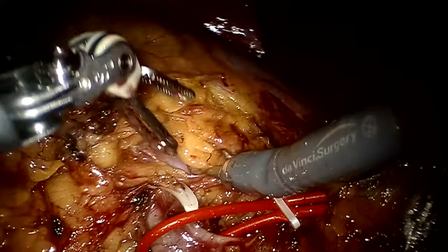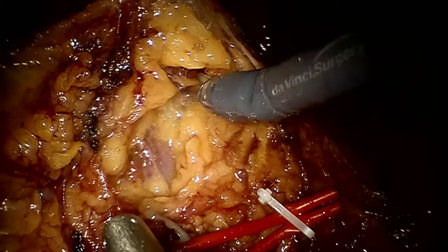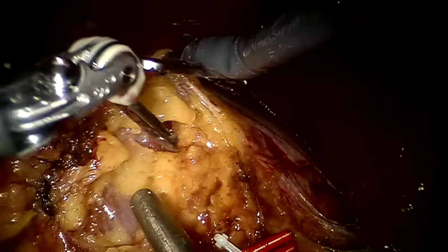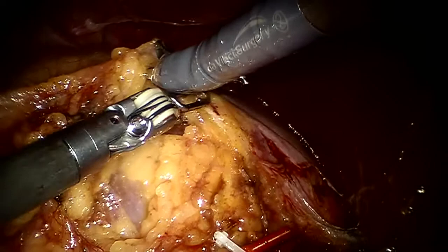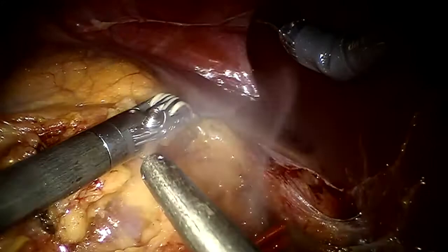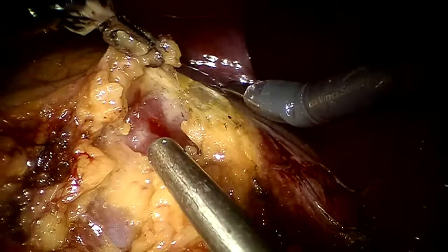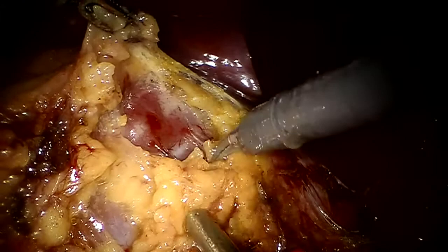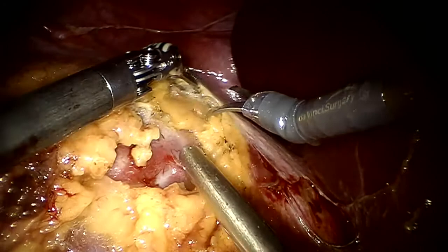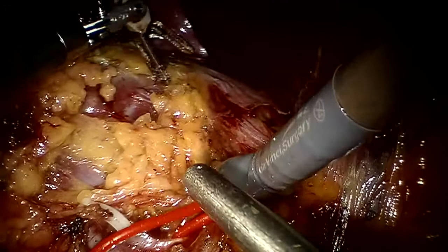Right now, I'm just going to mobilize the kidney. Are we live on the screen or no? Okay, I'm happy to talk to Vito. This is subcapsular, huh? A little bit, maybe? Adrenal area. That's the adrenal. See that?